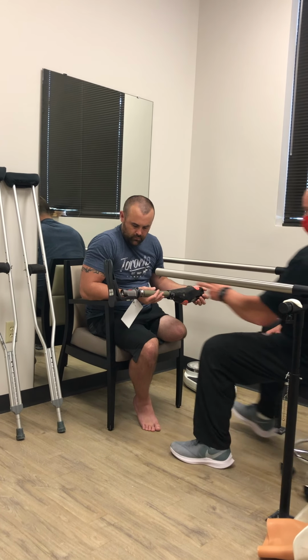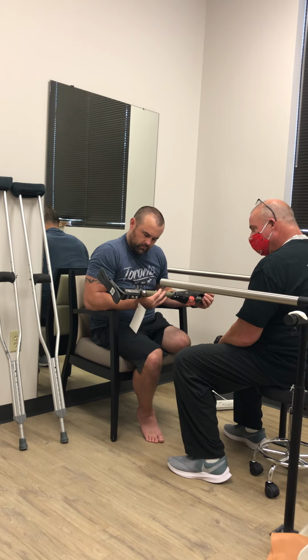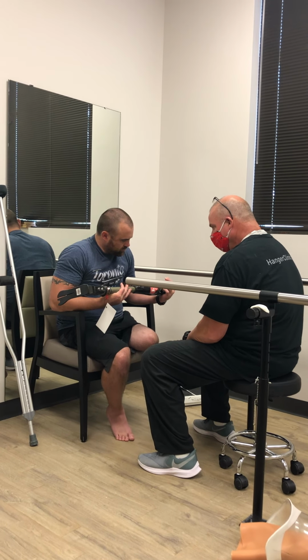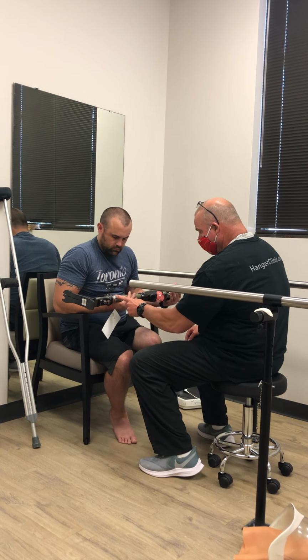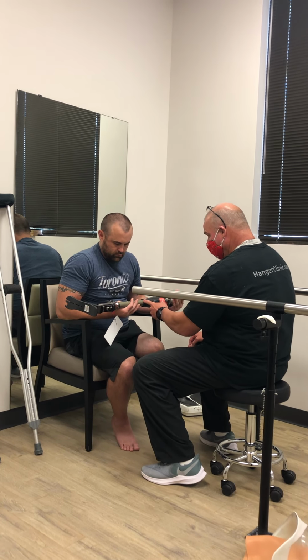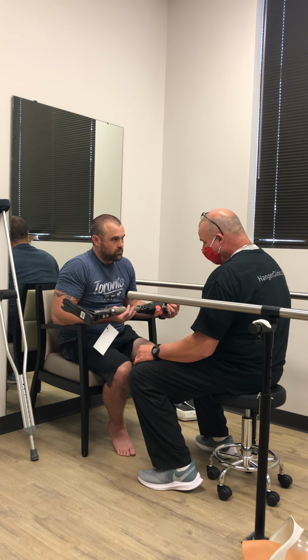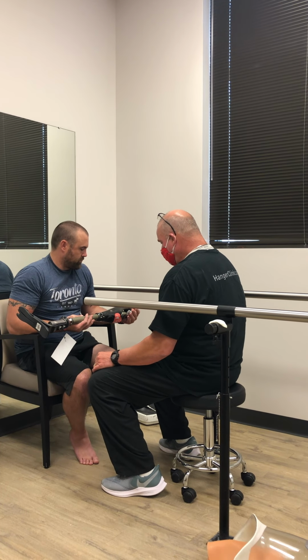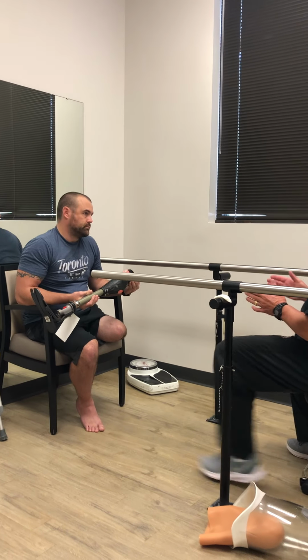Obviously, this will be a lot shorter up in here, but we'll determine that as we go. Actually, I'm gonna get a knee measurement on you today and see where we are. Hopefully my clearance is gonna be good. I'll probably honestly end up buttoning this right up into the bottom of the knee, because it's gonna be like 19 or something like that. And then with the rotator, we're gonna be tight.